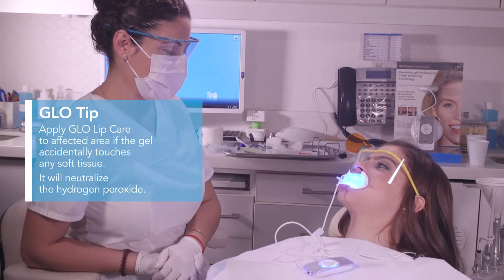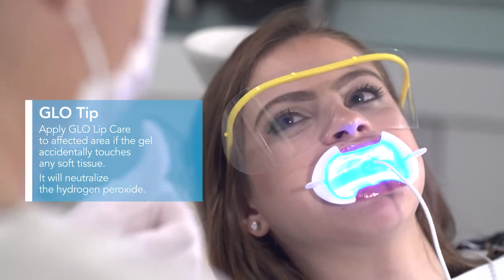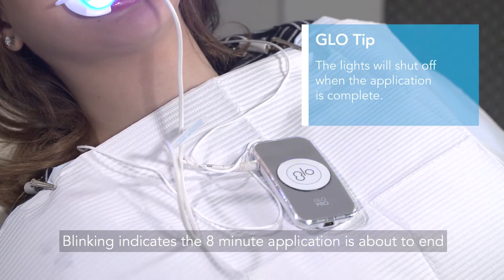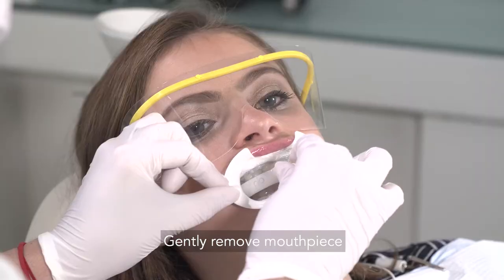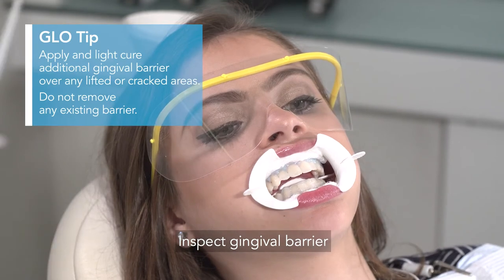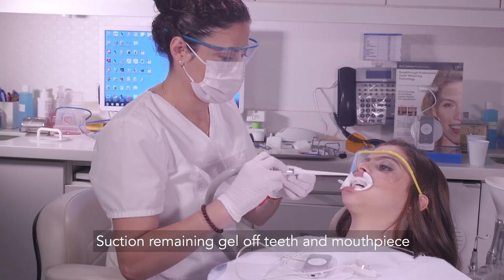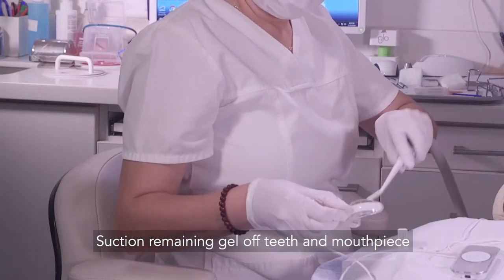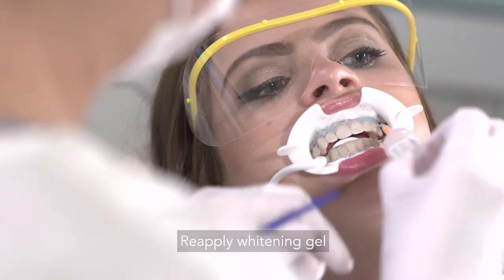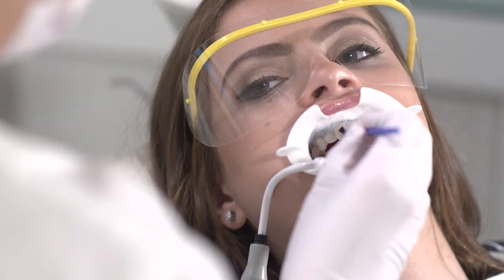Proper gingival barrier placement will prevent any acute sensitivity. The control will begin blinking when the first 8-minute application is about to end. Secure the lip and cheek retractor while gently removing the mouthpiece. Check to make sure that the gingival barrier is still intact in between each application. The patient gets to continue relaxing in comfort while you re-apply the whitening gel with a dot on each tooth — spread evenly with a brush, top and bottom.